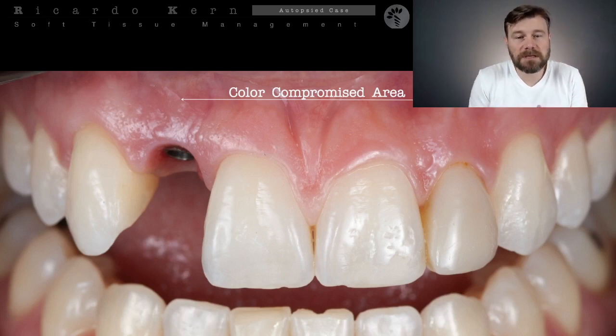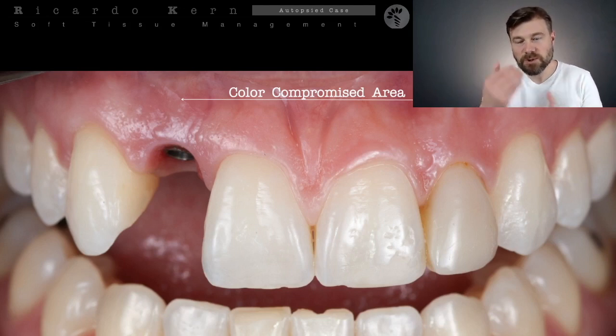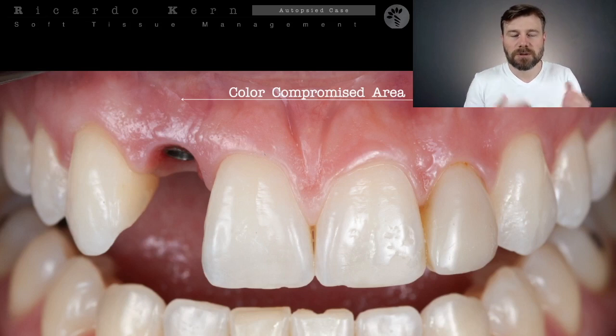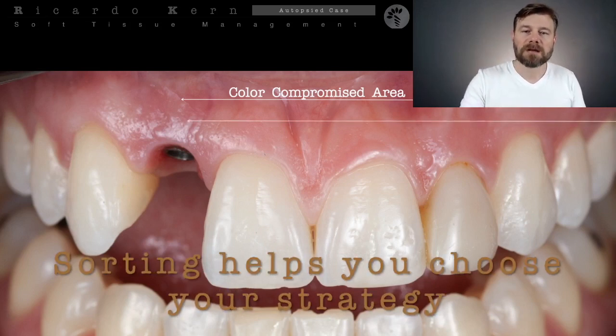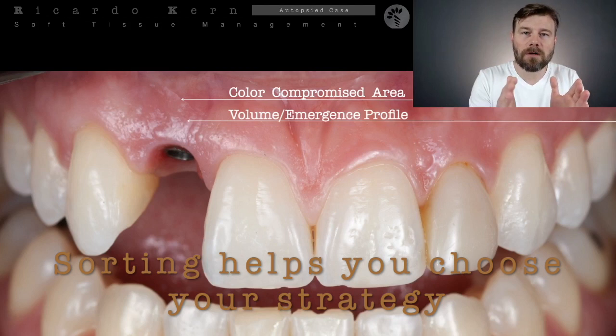Sometimes the abutment itself is the problem. And in the gray area, by translucency, we can notice this difference in the color of the implant on the surface. So we need to treat that: we need to increase the thickness of the soft tissue to block and avoid this difference of color.